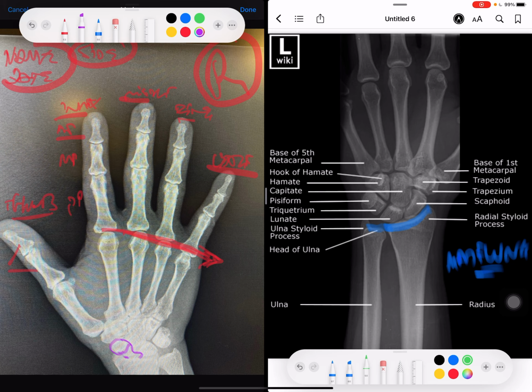So here we again remember the acronym. We use a little mnemonic. So this hand's like that, and it slopes down now. Okay? Right, it's a slope. And when the slope is gone, you'll see where the knuckle is depressed. When you have an old fracture, if you follow the slope with the flexed hand, if they've had an old fracture, it'll be depressed like this. And you'll see that, then you know they're an old fracture. Just on clinically examining them, the knuckle won't have a nice slope.